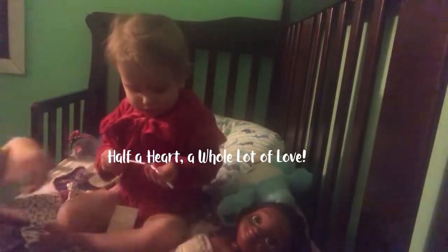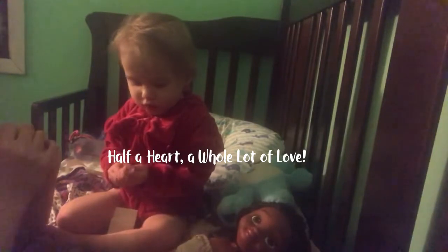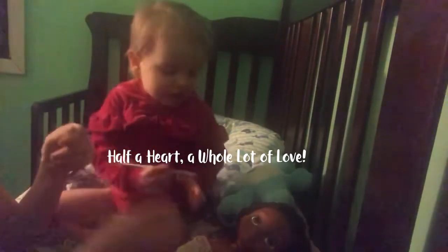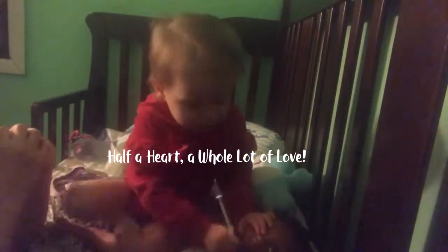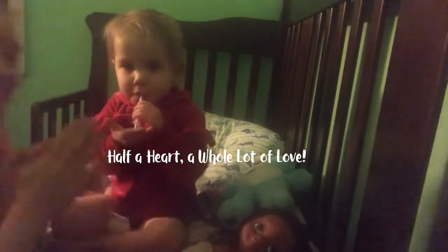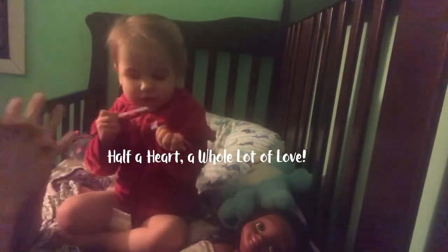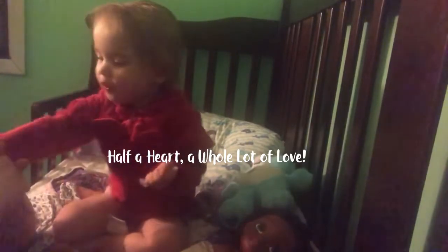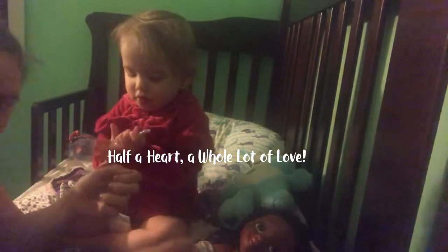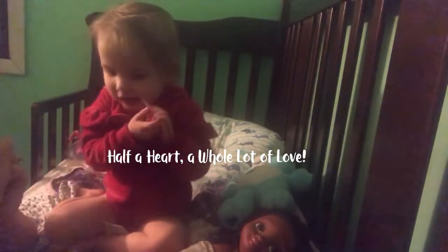Oh, good girl, babe. So I learned very quickly, one of the nurses actually showed me that tip. Not very many nurses even know to stretch the Teflon tape. Why am I calling it Teflon? Tegaderm. I'm very tired. This is me trying to do a video for everyone, so bear with me. But the Tegaderm tape stretches, and as you stretch it, it will detach itself from the skin. So that's basically my tips.